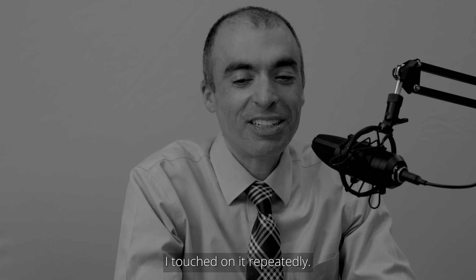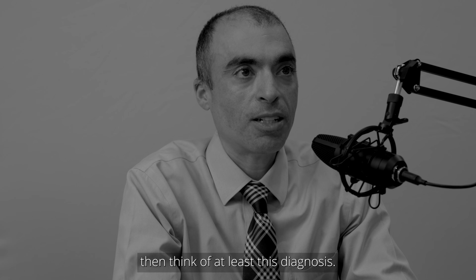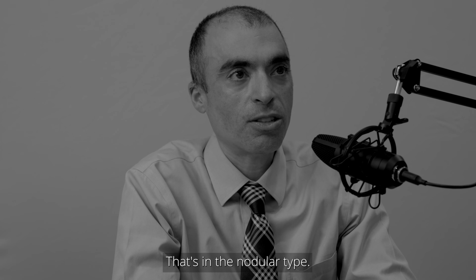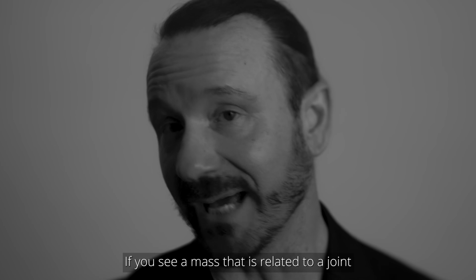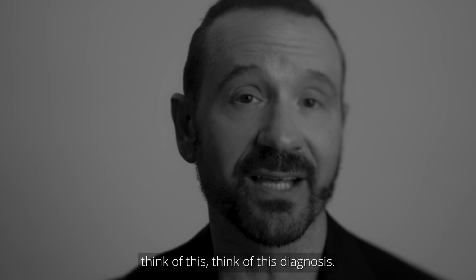I touched on it repeatedly. If you see a mass that's relatively low on T1 and low on T2 signal, MRI characteristics, then think of at least this diagnosis. Think of tenosynovial giant cell tumor. That's in the nodular type. If you see a mass that is related to a joint and it has certain MRI characteristics, low signal on T1 and T2, joint associated, think of this diagnosis, TGCT. Catch TGCT.